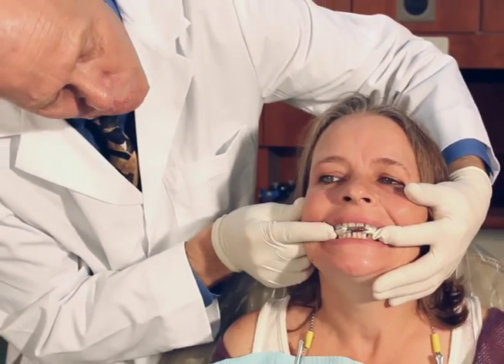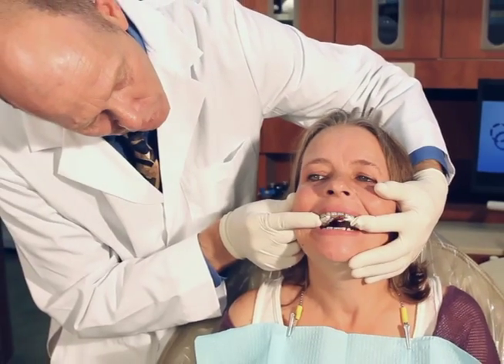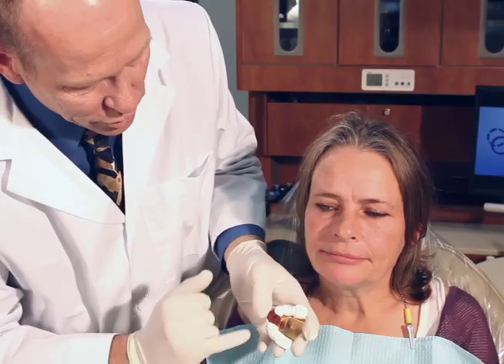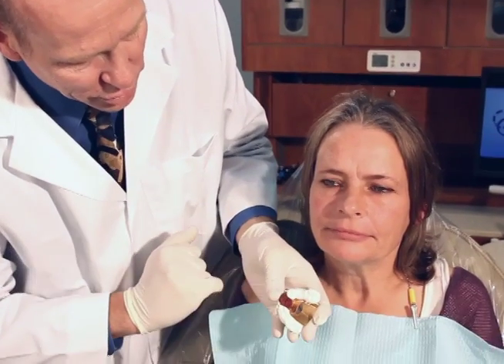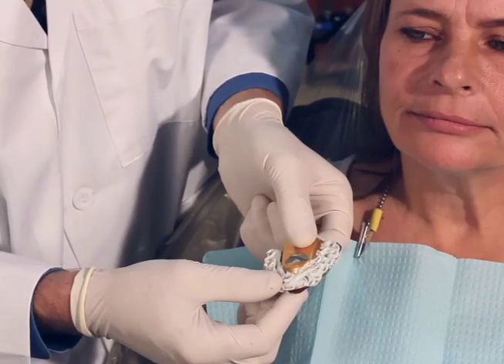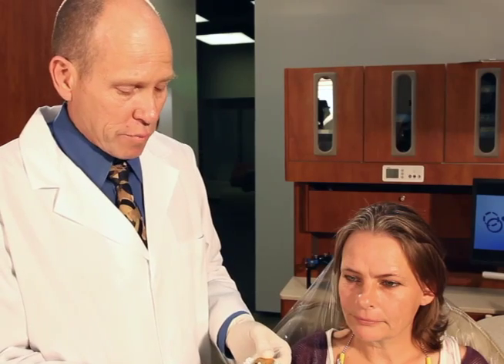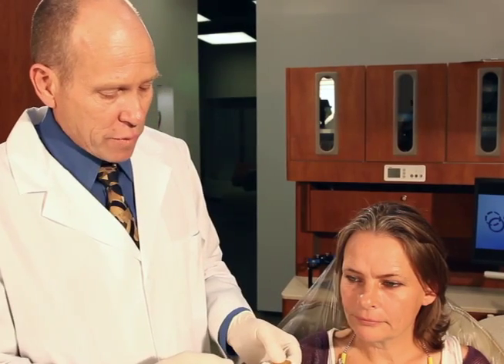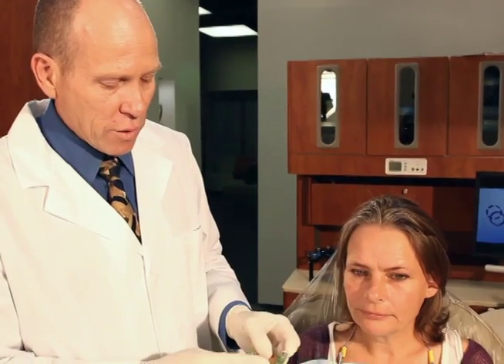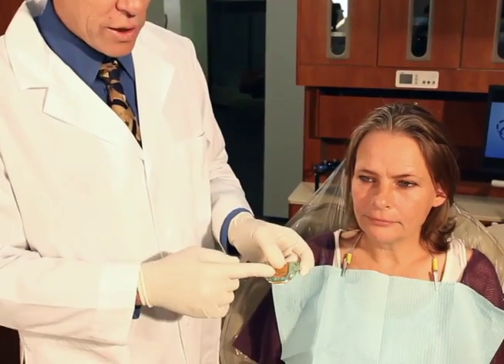While I hold the tray against the upper teeth, have the patient open their mouth. Now I can go ahead and remove the tray. We do have registration of the posterior teeth into the bite record. This will be used for mounting the lower cast when we get to the laboratory procedures. In preparation for doing the protrusive check bite, the upper surface of the bite tray is exactly the same as the centric record — the only difference will be the lower compound jig index instead of a centric index.